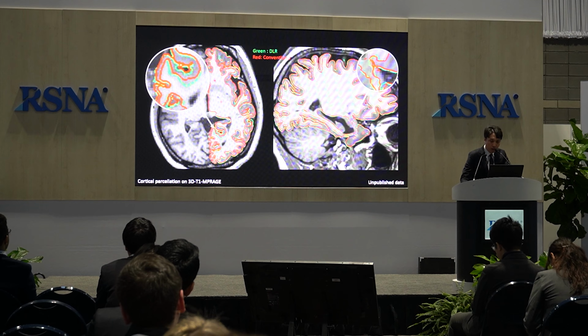Similarly, for 2D T2 weighted image, the standard scan time is about 2 minutes and 22 seconds. The accelerated image is about a minute shorter. With Swift MR reconstruction, the image is similar or better than the standard scan. Overall, the gain is 51% scan time reduction.